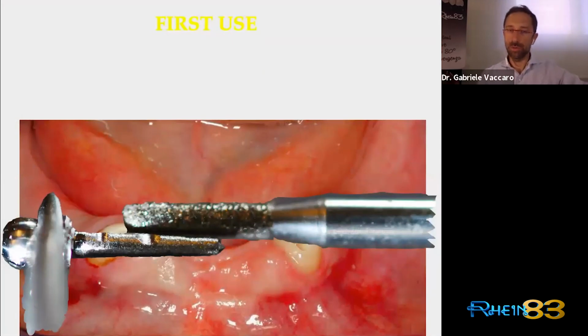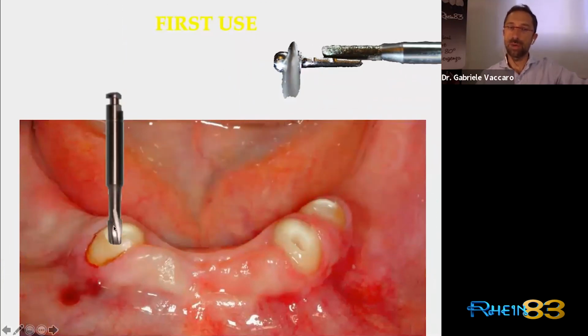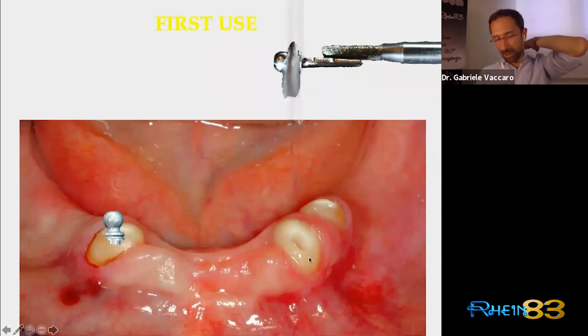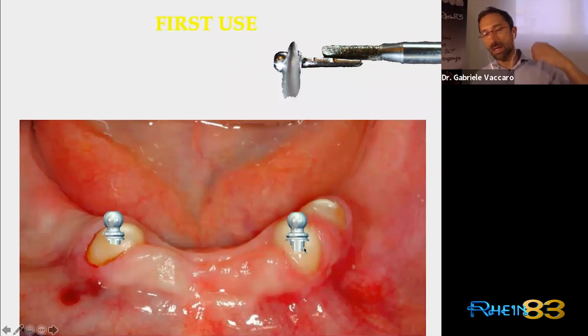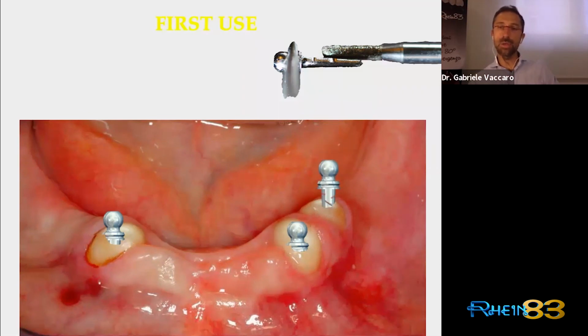And as you saw before, first of all, I want to reduce the volume and the shape of the pivot, to give more resistance to the root, and then first of all make the right space, and not too much, otherwise we are going to crack the residual root in a short time, and then glue in the pivot.